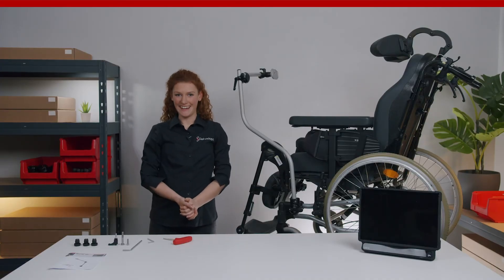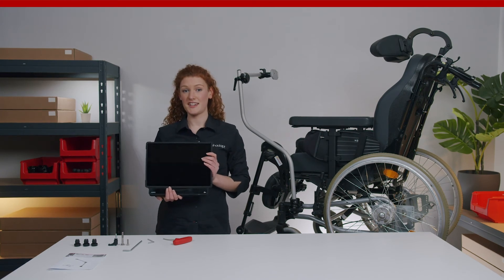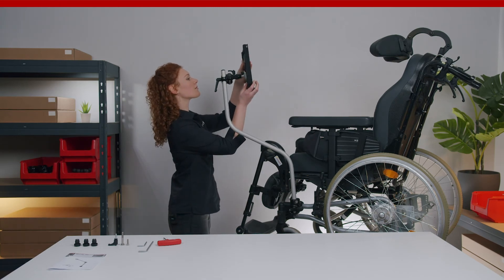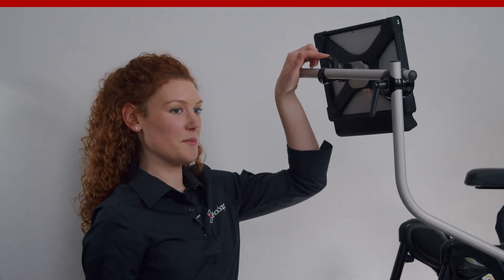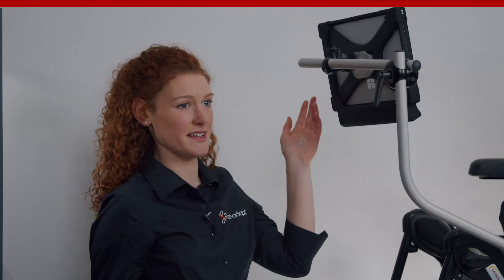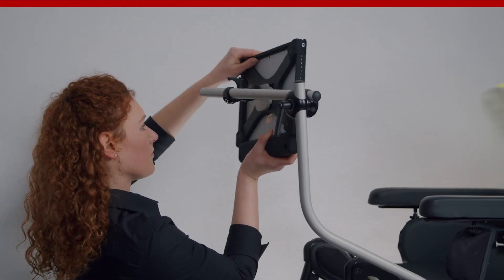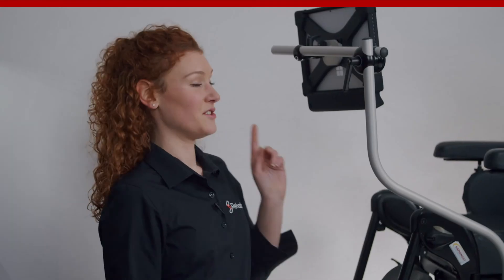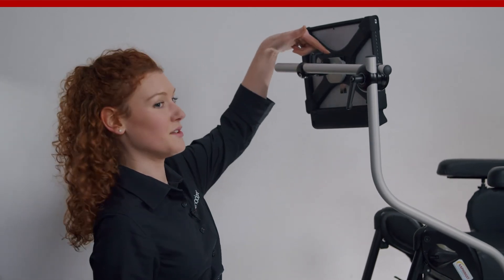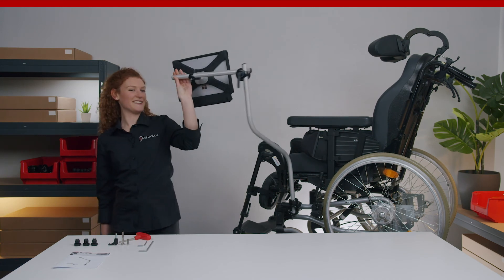Now we attach the eye gaze device. Here it's important to always support the device when adjusting its orientation. It is really important that you never adjust the ball joint without opening the quickshift lever first — otherwise you will damage the UDS. This ball joint allows you to fine-tune the orientation of the device. When you tighten it again, make sure that the lever is aligned with the UDS. And that's it — as you can see, it swings easily in the exiting and in operating position.